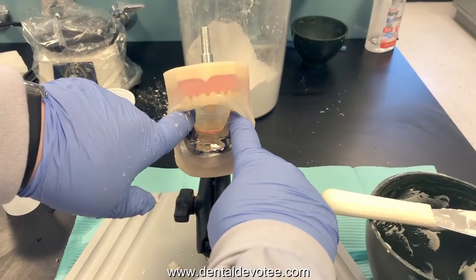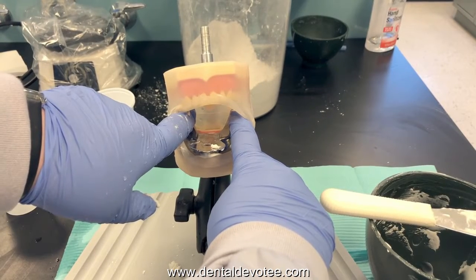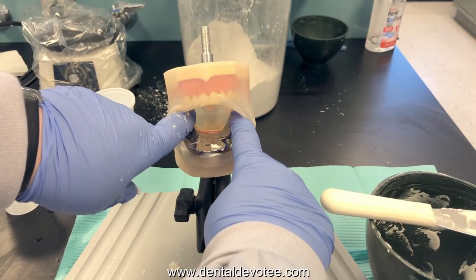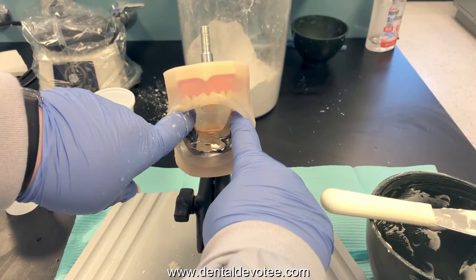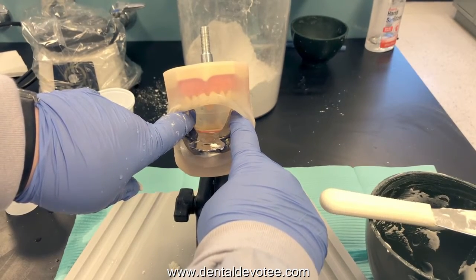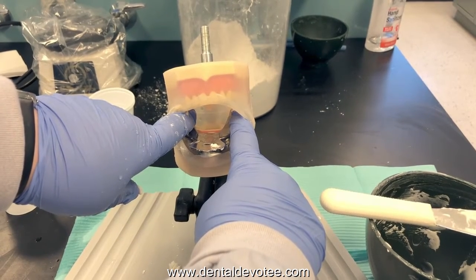As far as operator positioning goes, some operators like to stand behind the patient. I prefer standing behind for maxillary impressions and standing in front of the patient for mandibular impressions — it depends on how easily you can see what you're doing. I like to keep an eye on the alginate as well as the patient. I can see their reactions if they're getting a little irritated or having a difficult time. I can talk to them, encourage them to breathe through their nose, to cross and uncross their legs, to keep their mind off having this in their mouth.